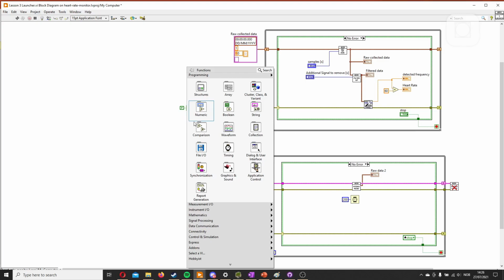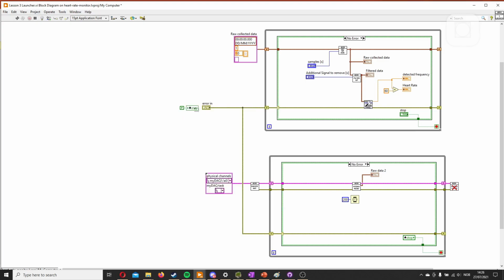And then we can encapsulate this in a flat sequence structure. Using a flat sequence structure is usually useless. Most of the time there's a better solution. I only use it for this, just to collect things into one loop that I want to stop immediately, or for very specific FPGA or timing issues. So what happens now is that the first thing the application does is to set the stop button to false, because these two loops wait for the input here and here to start, and this won't be done before everything in this loop is done. So now we've set up the stop button.